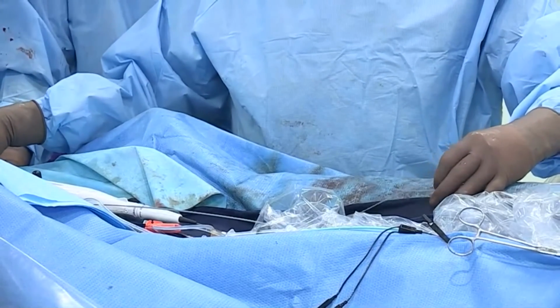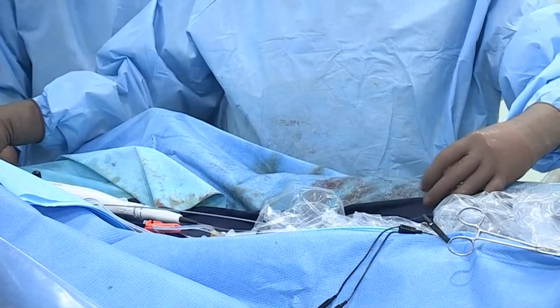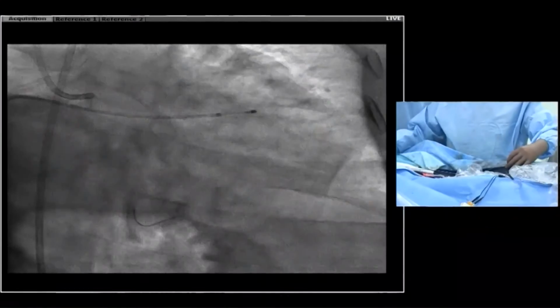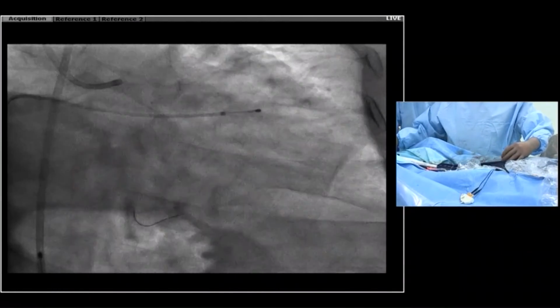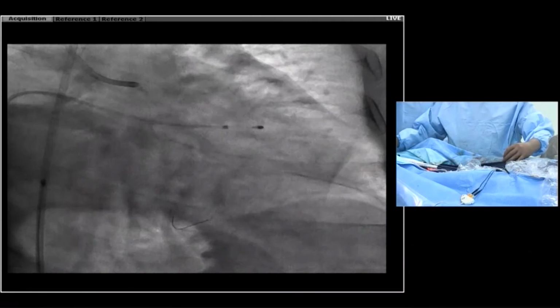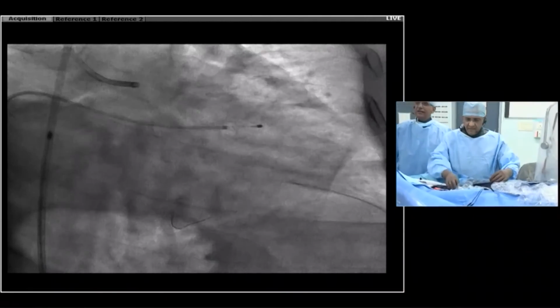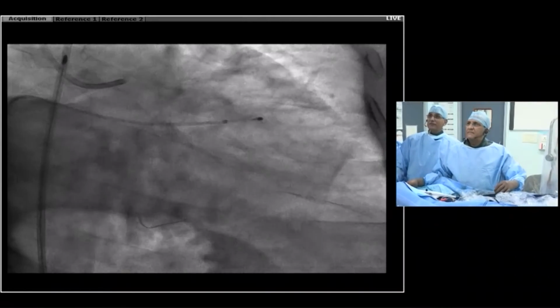So look at this. I'm just doing a fluoroscopy for your sake, but it's all steady. You can see both my hands moving. Kirti, show it's fluoro. It's fine that you're an experienced operator, but somebody who's starting, be very careful. Yeah, there will be a loop in the wire in the ascending aorta. But the problem, Ajit, with the rotablator is that sometimes you see that would be a disaster if you have a loop and you don't have experienced operators.